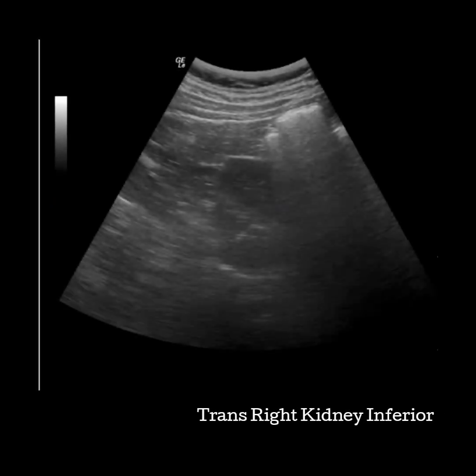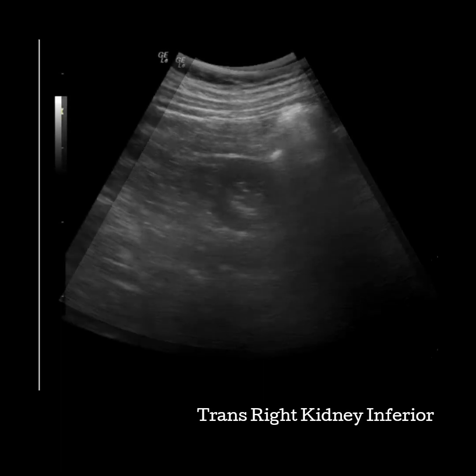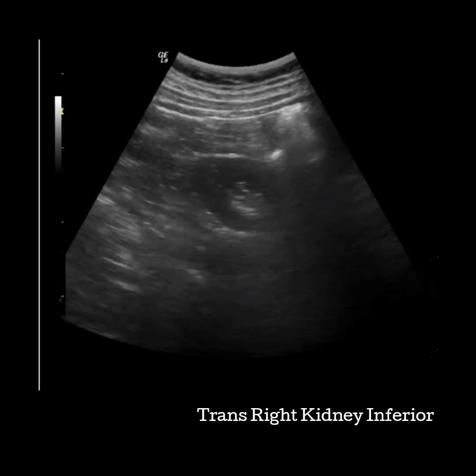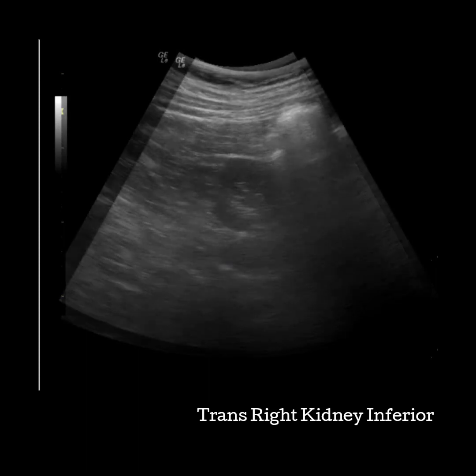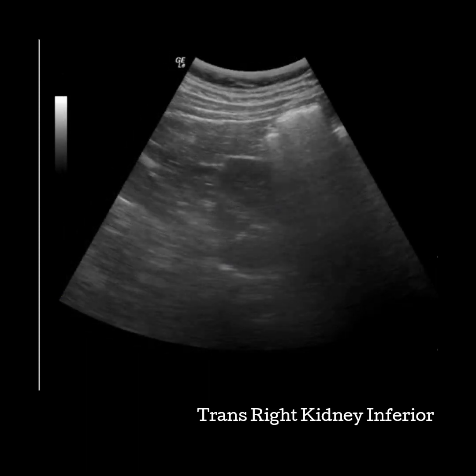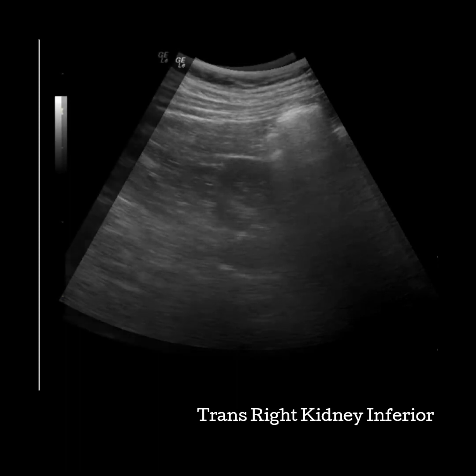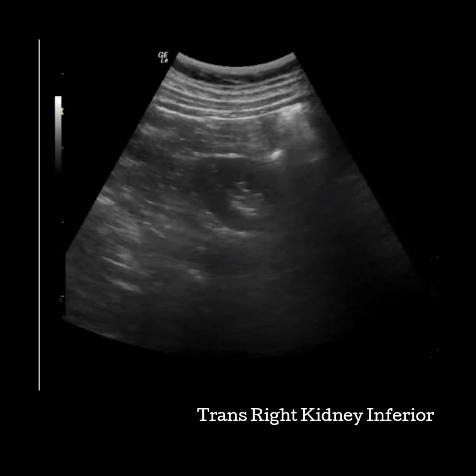Keep moving your transducer towards the patient's feet. You may need to turn your transducer slightly to keep the poles circular. Make sure that this image truly looks like renal parenchyma and is normally only surrounded by bowel and muscles. In these examples, we can again see the choice of coming all the way out of the sinus or having a little sinus visible.